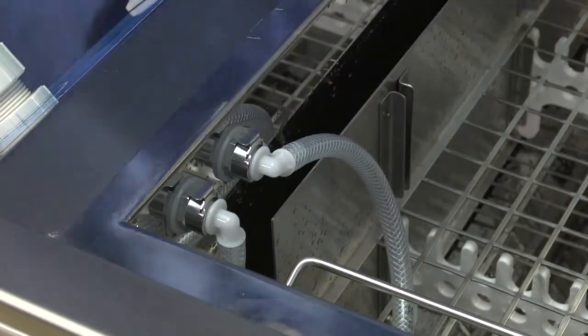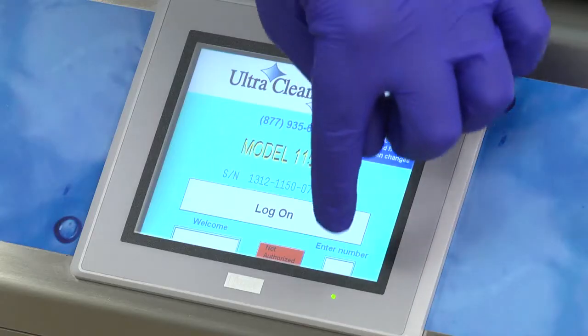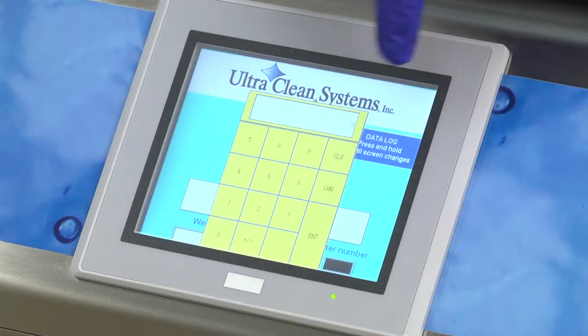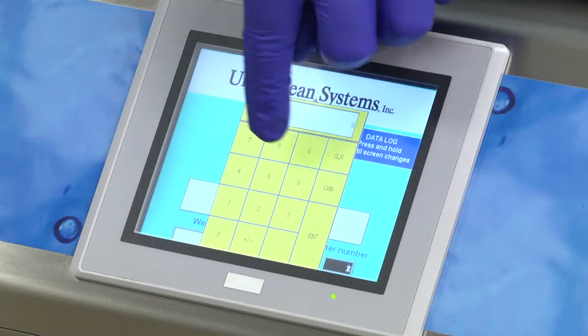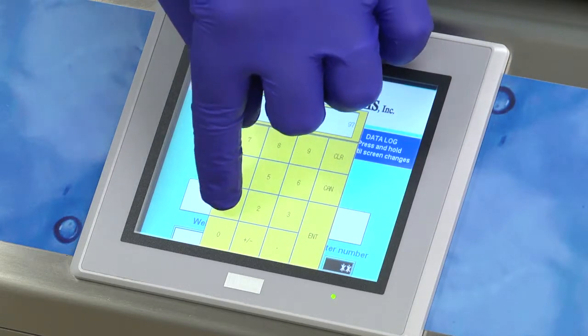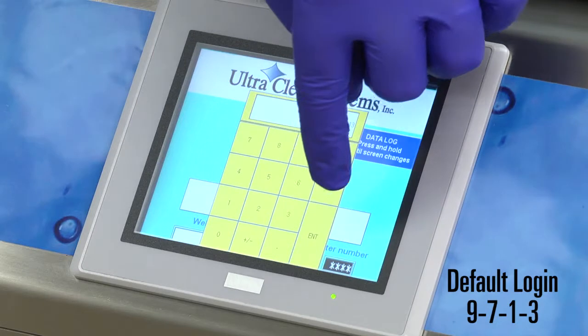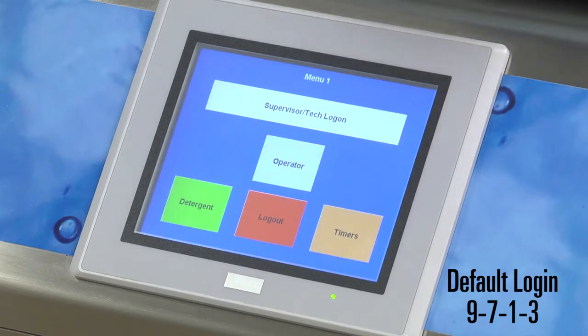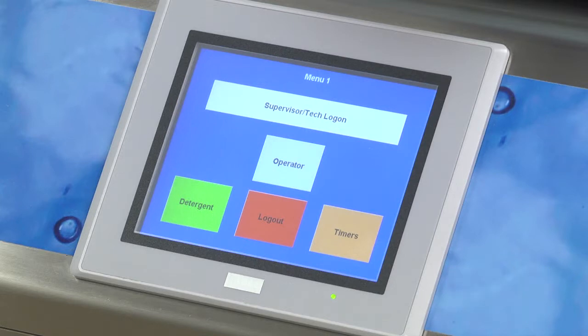Once both baskets are loaded properly, close the lid. To log into your system, press the enter number box on the screen. A number pad will be displayed where you should enter your identification login code and press enter. The default login code is 9713. This will bring up the menu one screen.